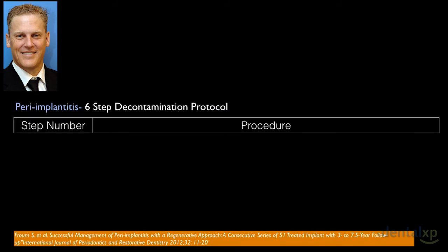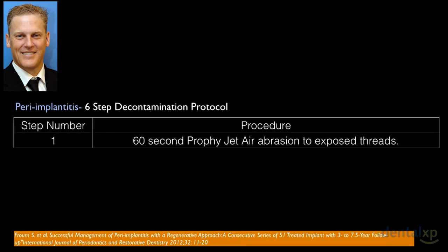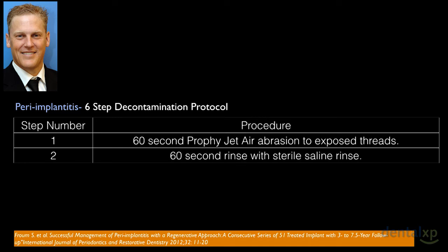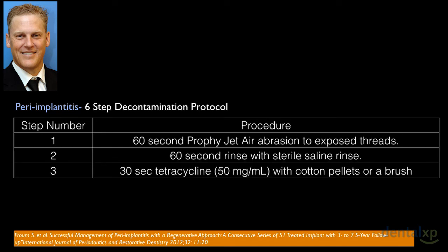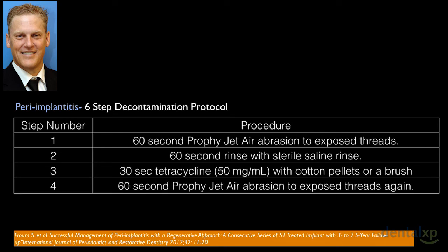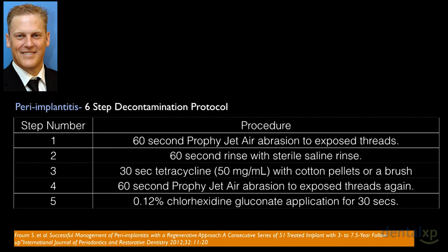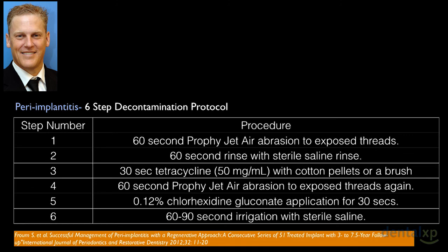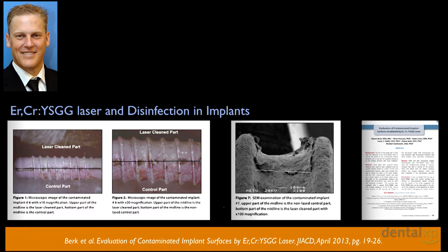When you look at the protocol that he uses, it takes about 5 to 6 minutes, and it's also fairly messy because it involves 60 seconds of air abrasion, a rinse to clean, 30 seconds of tetracycline paste with a cotton pellet, and then another 60 seconds of air abrasion, followed by chlorhexidine gluconate, and another 60 to 90 seconds of sterile saline. So everything but the kitchen sink to try and detoxify the implant surface. How can lasers perhaps be used for this detoxification process?